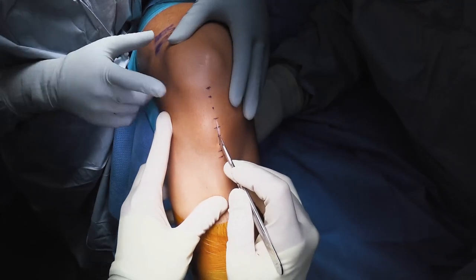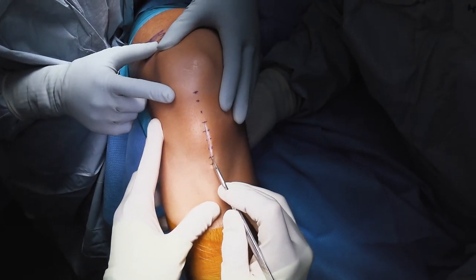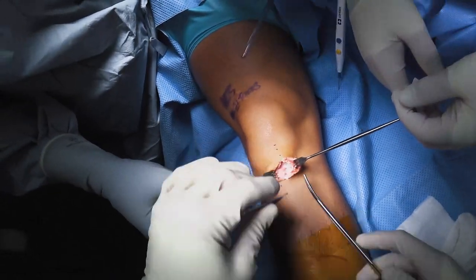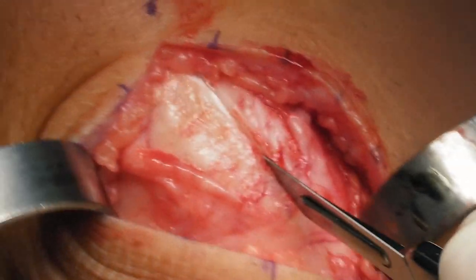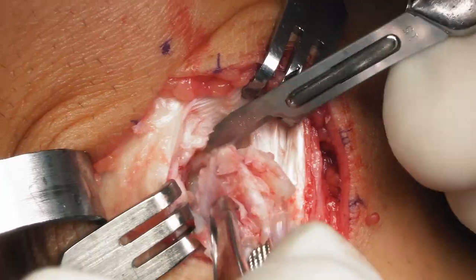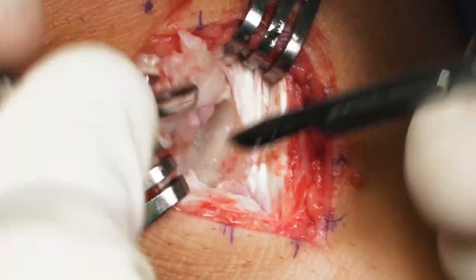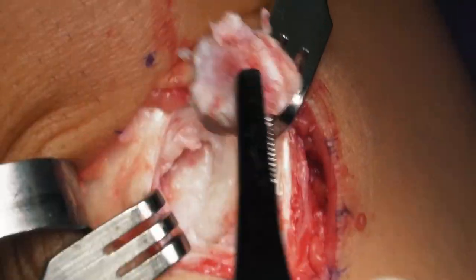Our goal today is a very simple surgical procedure: to make a small incision, split the peritenon, and split the patellar tendon in line with its fibers to expose this large painful ossicle.